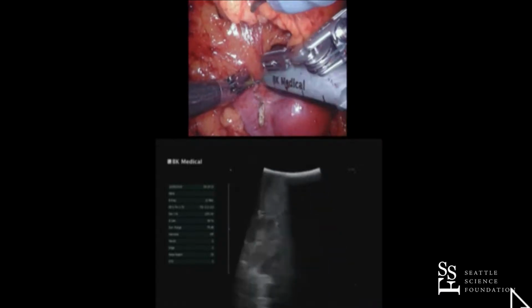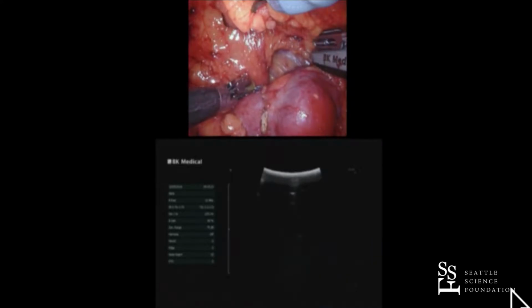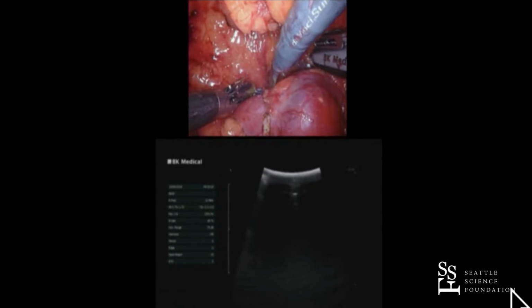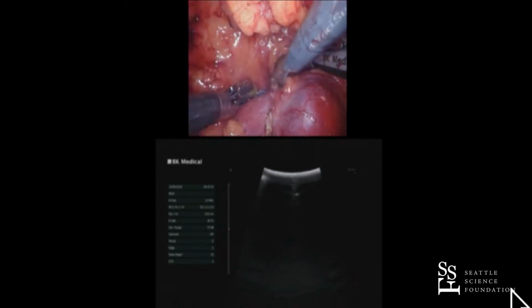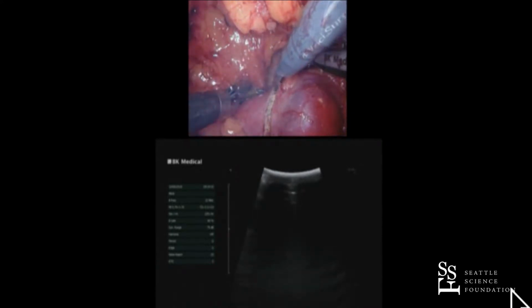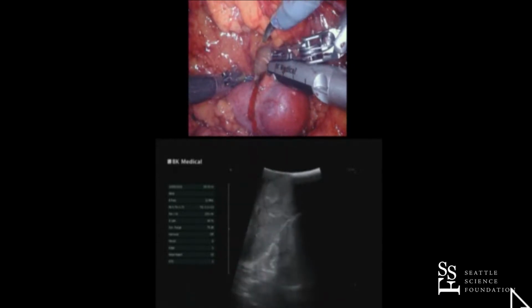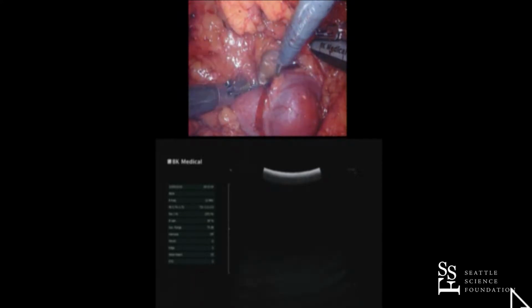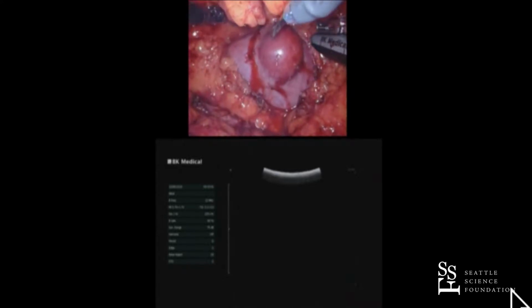So I think there are some people who are tempted to want to have like a 0.5 millimeter margin or something really tiny. And I would discourage you from doing that, particularly if you're not a super experienced surgeon and you're just doing a few of these a month or a year. The reason is because the biggest priority in this specific patient right now is a negative margin. She's relatively young. She's going to live for another 30, 40 years. She doesn't want even a micropositive margin. She wants a negative margin. So saving an extra 5,000 nephrons is not going to make a difference to her long term. So just get a negative margin.